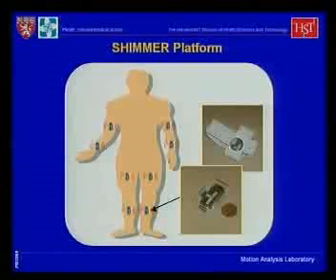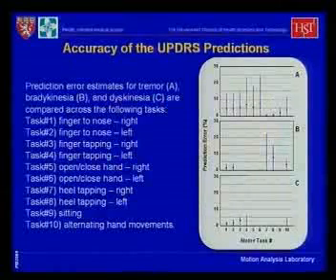So there are still a few limitations with this technology, but this is technology that allows us to gather data over a day with a sampling rate of about 100 hertz per channel, and not only gather the data through wireless communication, but also has the flexibility of dumping data on an SD card that's actually sitting on the nodes, which is a way to guarantee that even if we have problems with the wireless, because we start losing packets and things of that nature, the data are intact.